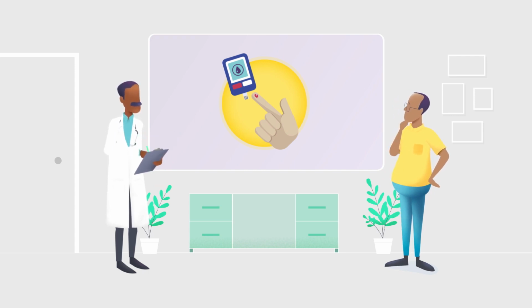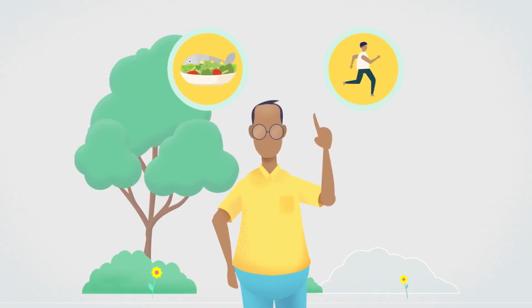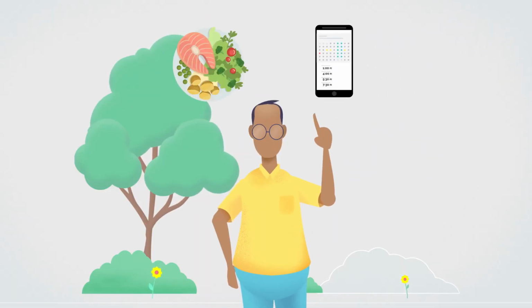Viewing your logs can also help you understand patterns in your blood sugar levels at different points throughout the day. This information can help you strategize your diet and exercise goals to keep this level within the target range.